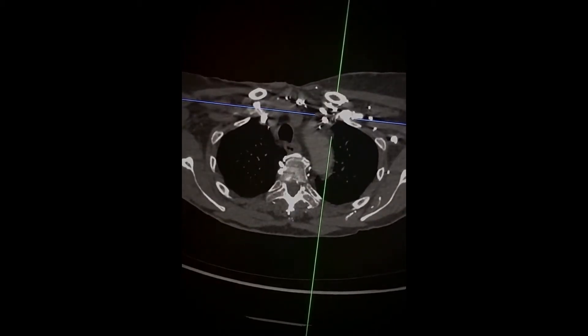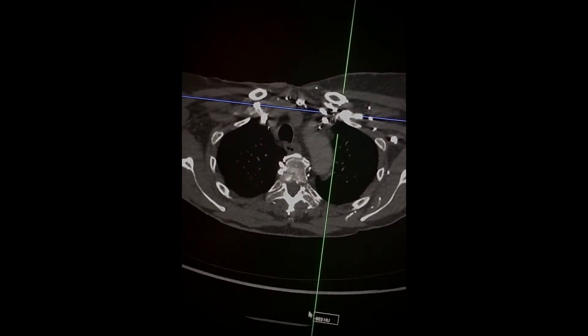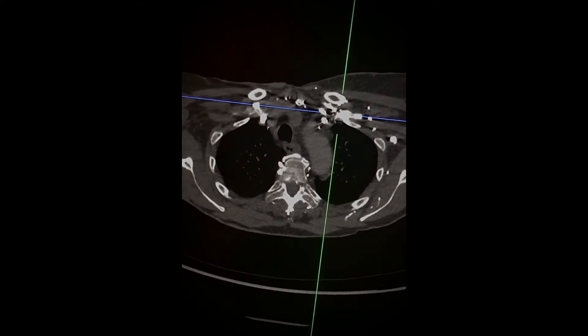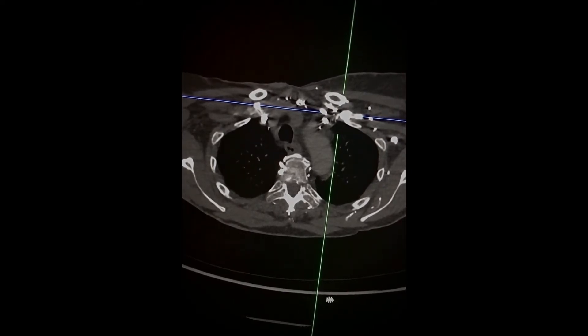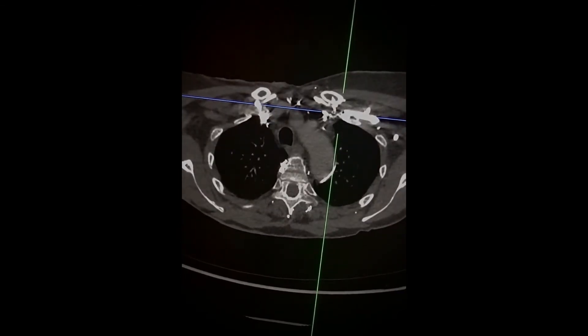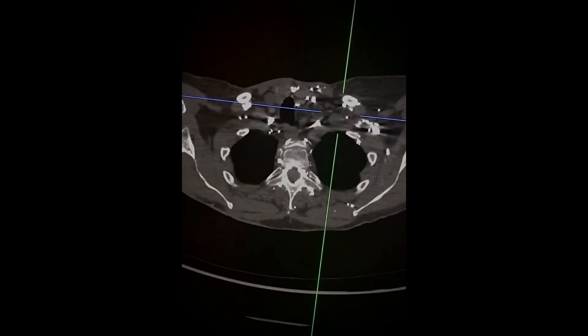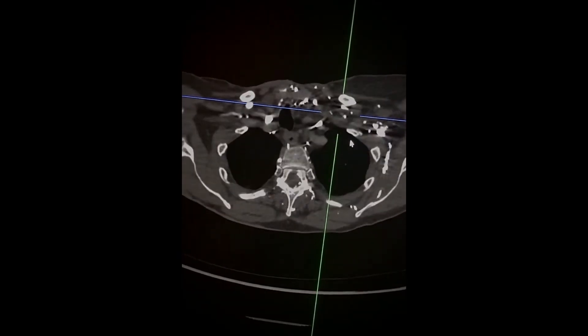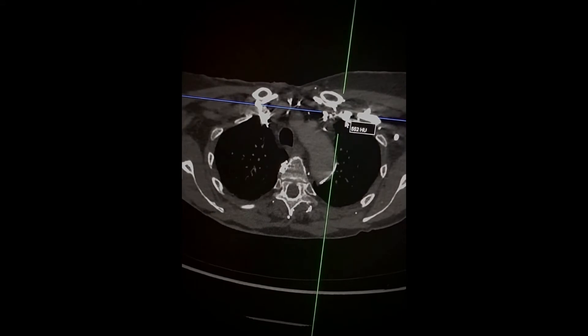The contrast comes to the point of the thoracic outlet but then diverts away. There are several structures which can hinder its passage here, the most common being a bony obstruction due to the course of the clavicle and the first rib.